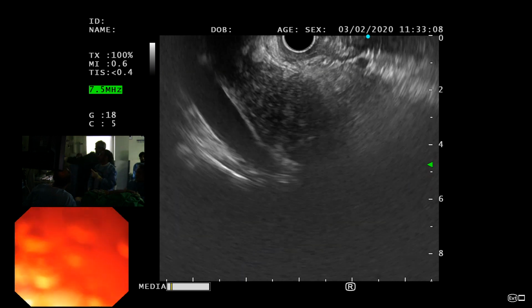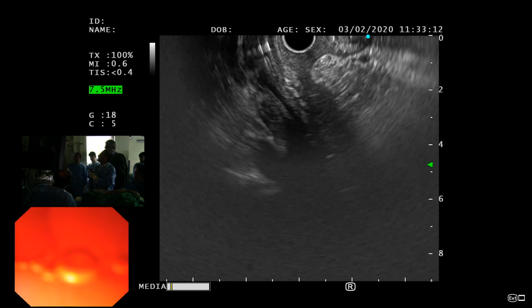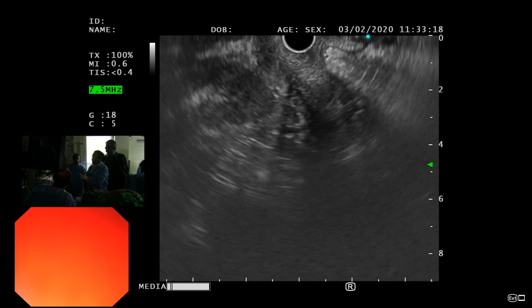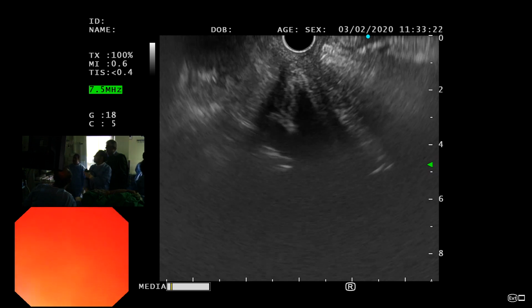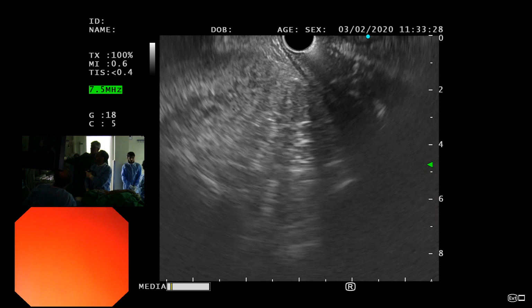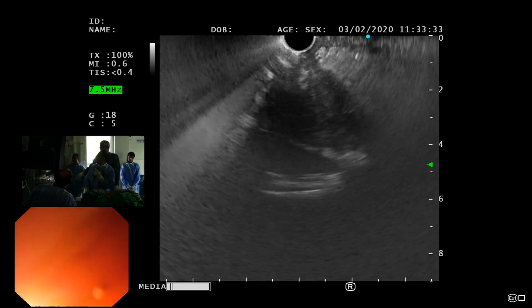दैट्स योर पैंक्रियास, दैट्स द पोर्टल वेन देयर. इसको नीचे लेके आना है. स्टेंट ये आ रहा है. ठीक है. ओके, अब आप क्लॉकवाइज करो, थोड़ा सा पुल बैक करो, लेट गो, बिग व्हील को थोड़ा रिलैक्स करो. नो, आप थोड़ा आगे चले गए. वी स्टार्टेड सीइंग राइट किडनी. व्हेनेवर यू स्टार्ट सीइंग द राइट किडनी, दैट मीन्स यू हैव रियली गॉन फर्दर. सो यू कम बैक.